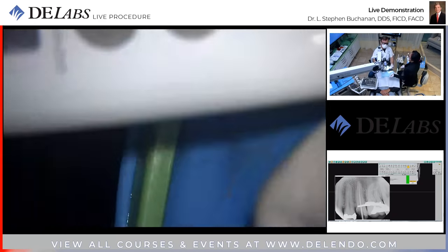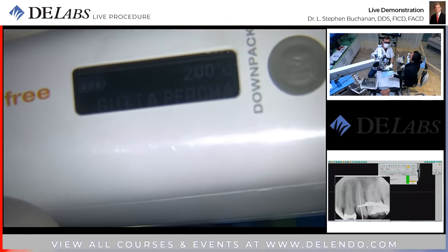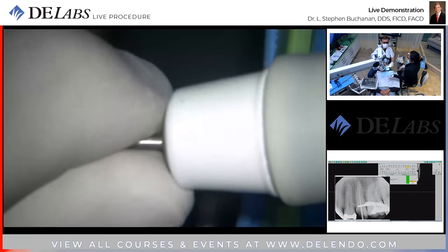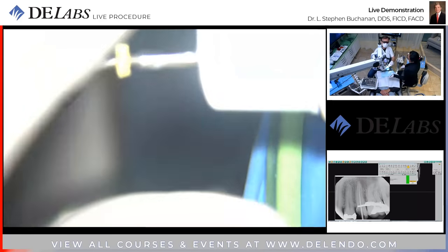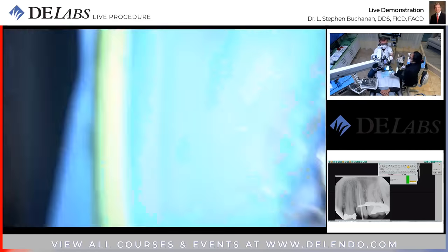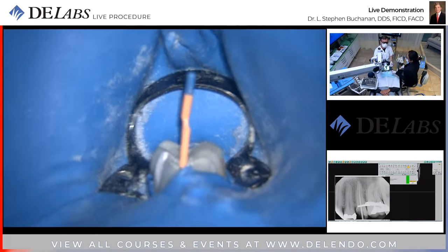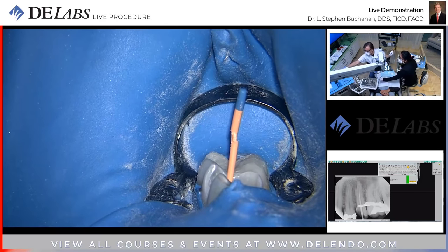The button's turned on here. We've got a 200 degrees C setting, the ring switch here. We don't need to tighten a collet. There's a spring tensioning here that'll hold it, and there's a little hex nut there to keep it from rotating. So let's do the down pack. And oh, I need to throw another cone in there first.